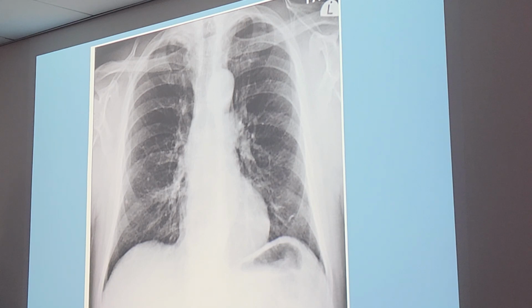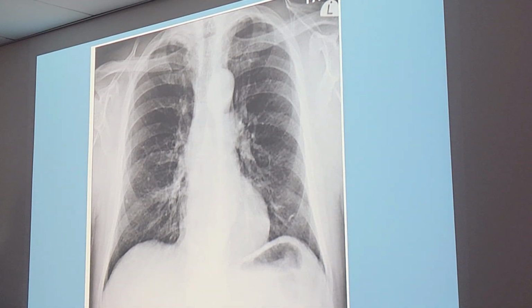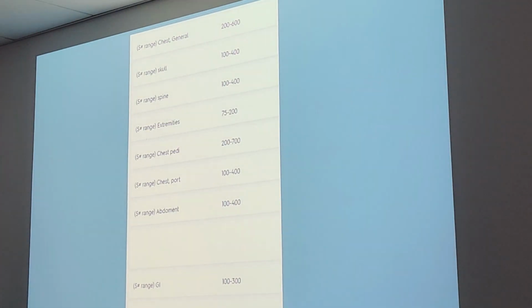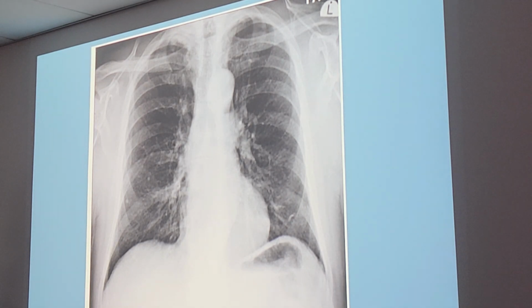What is that right here? Yeah, that, I believe, is a portacath. A little port. Ma'am, can you point at it? Right here, this circle. You can see the kind of tubing that's coming down. A portacath is used to give the patient medication. It can be used to draw blood, different things like that. It's under the tissue.